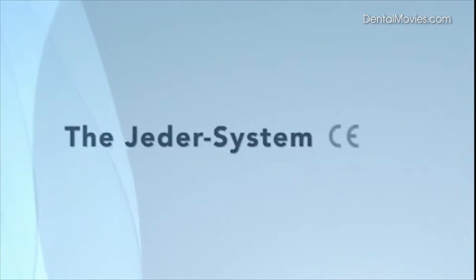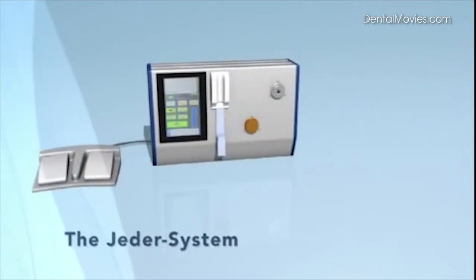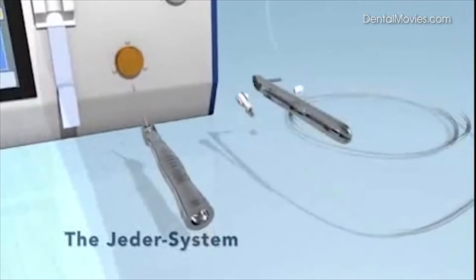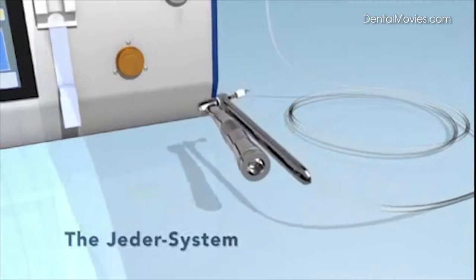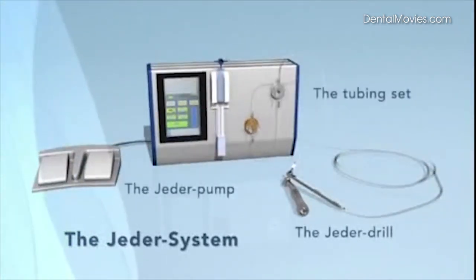The Jeder system is CE certified and consists of three components: the Jeder pump with control display controlled by foot pedal, the Jeder drill as the actual surgical tool, and the tubing set that connects the Jeder drill to the Jeder pump.